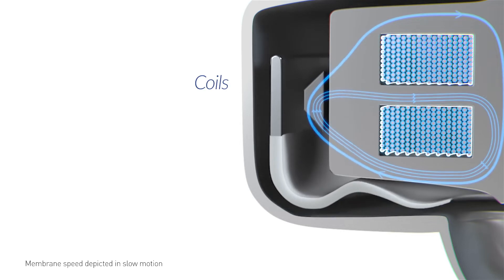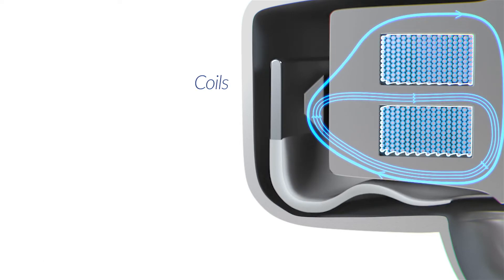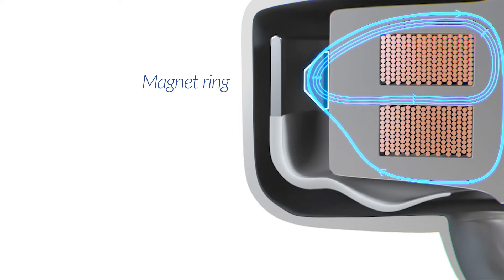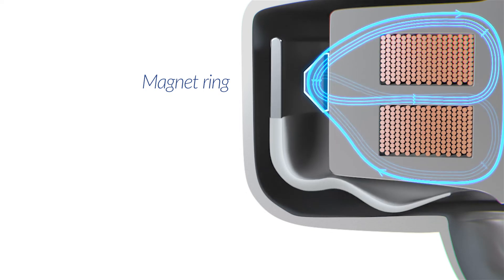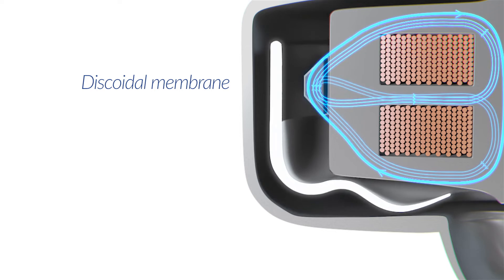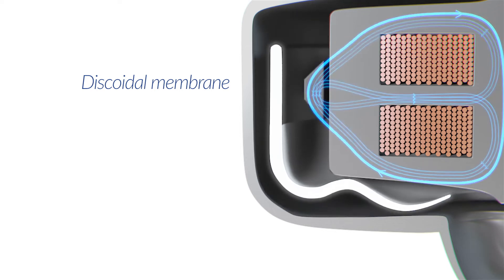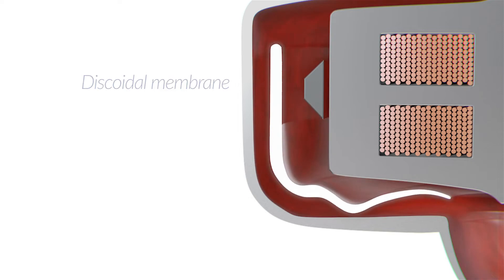As current runs through the coils, magnetic fields generate oscillations in a magnetic ring. These oscillations trigger a wave propagation along the discoidal membrane, which propels the blood inwards.